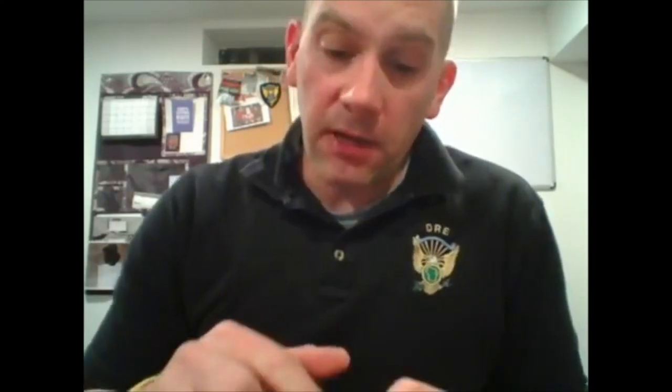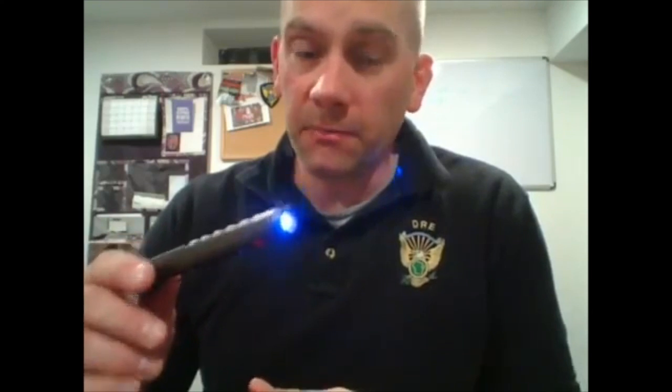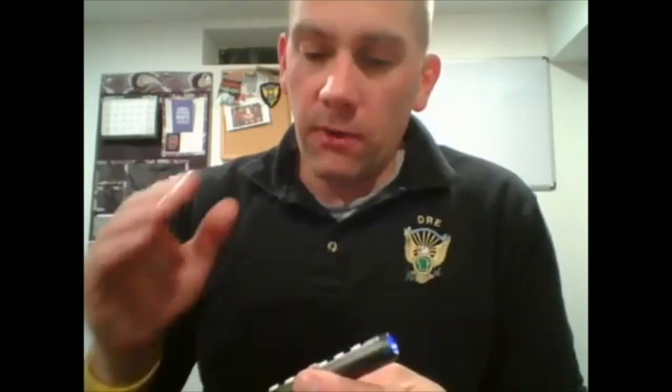What I thought was great — very DRE-specific — is you hit the function button, this bottom button right here, and it goes right into the UV light. That saves me an extra tool in the darkroom. I would caution, though, if you are going to use a UV light, to check out the video produced by IACP back in 2014 that goes through the criteria for using a UV light, because if you don't do it correctly, you will distort the pupil size. So make sure you check that out before using any UV light.